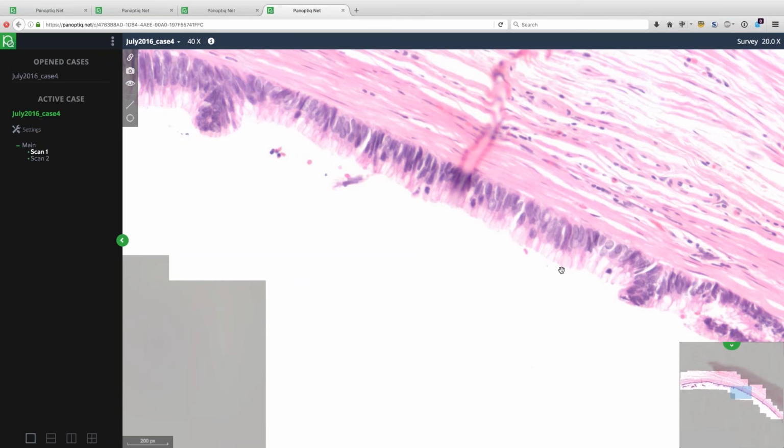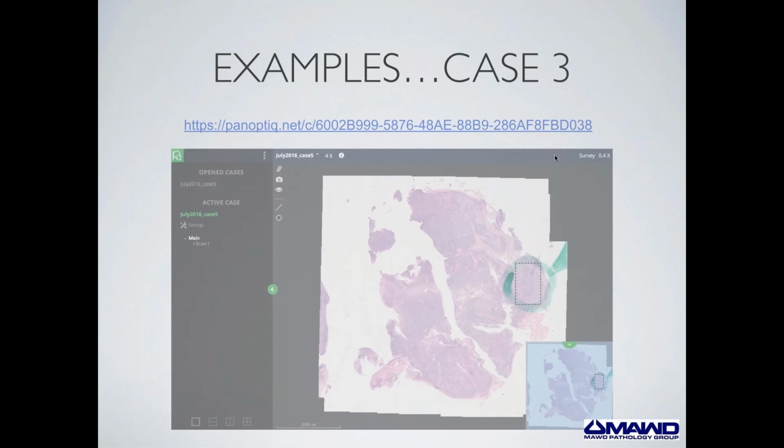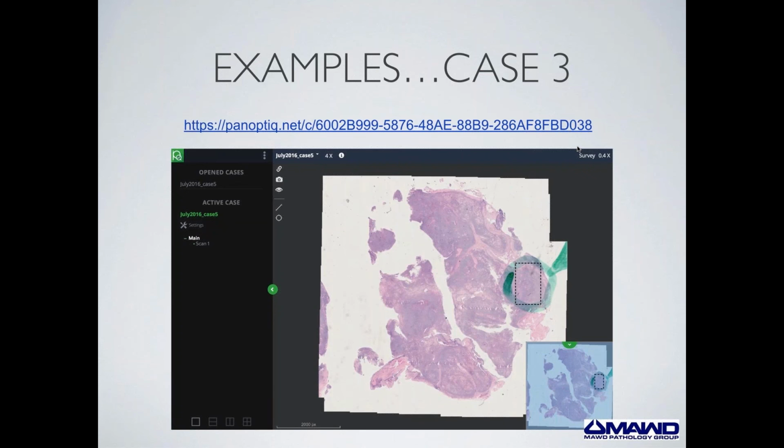Case 3 was an excisional biopsy of a retroperitoneal mass. It was sent to us as a mass in a patient that had no specific clinical issue, so there was no lymphadenopathy or tumor masses that they could see, but the patient had presented with some CBC abnormalities. There was a subsequent workup performed, and go back to low magnification, Richard.